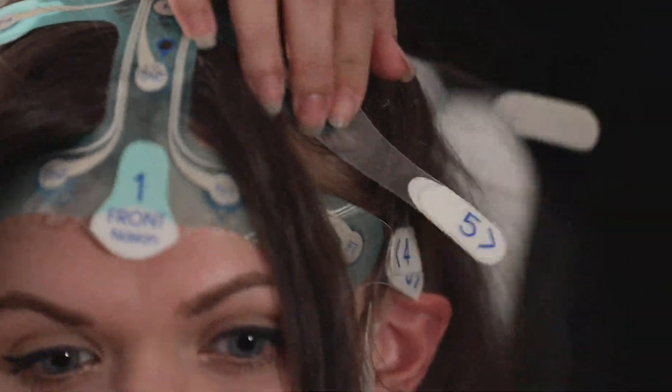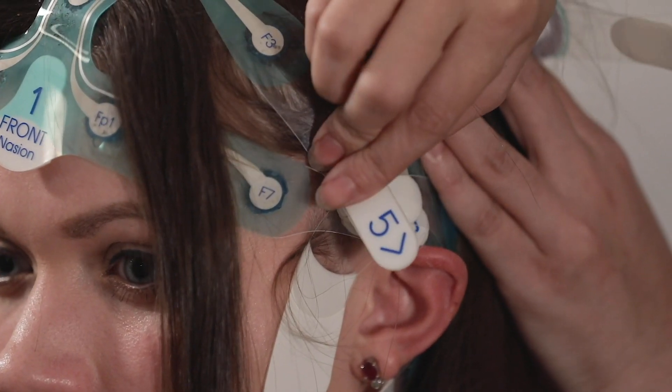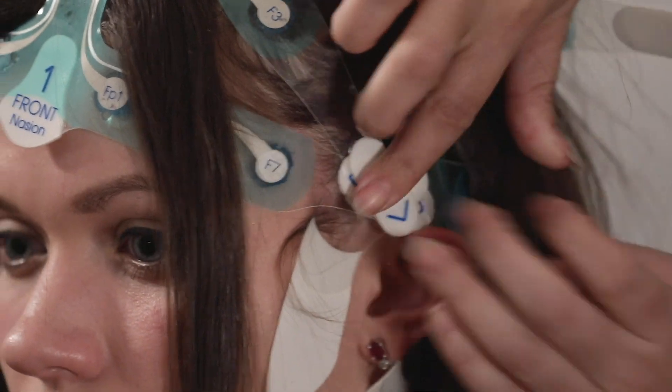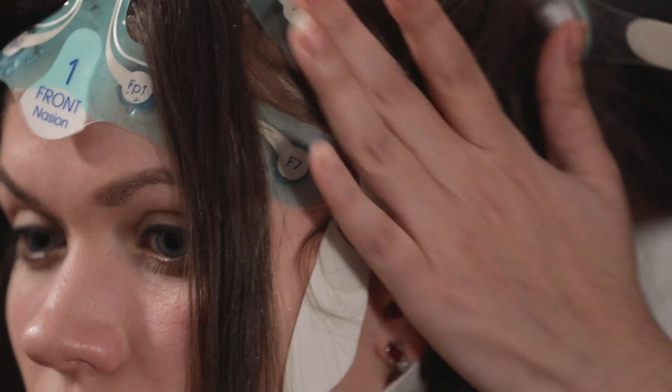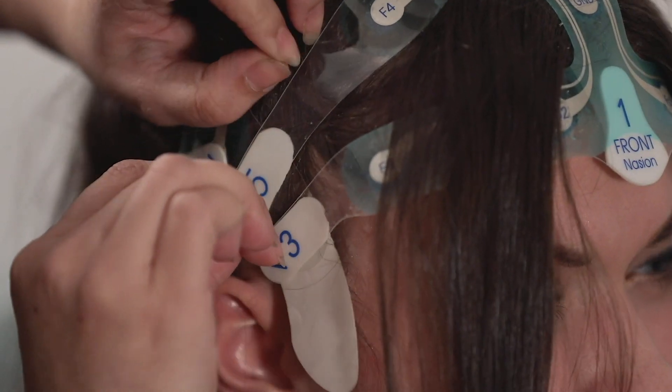Apply strip number five diagonally over the top front of the head and place above the ear. Make sure sponges F3 and F4 are flush against the patient's head. Repeat for both sides.